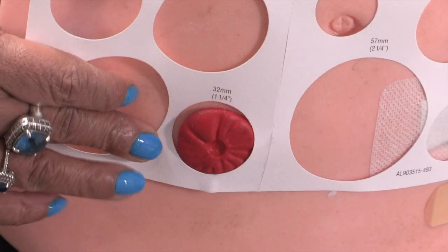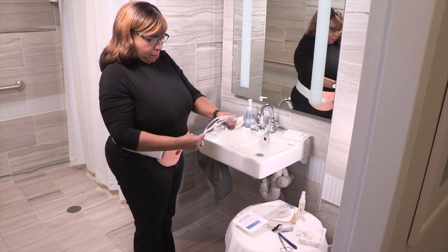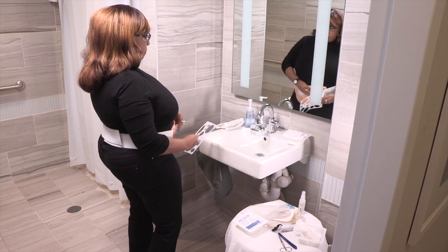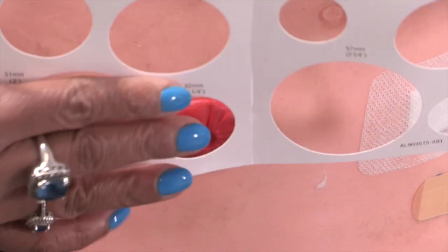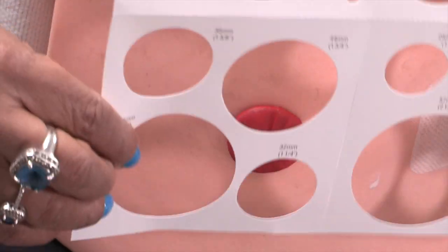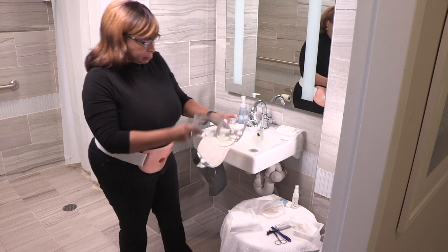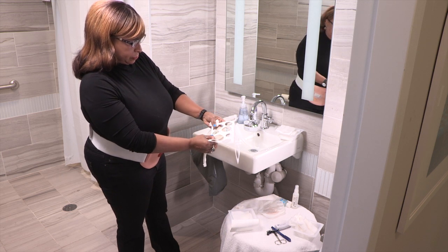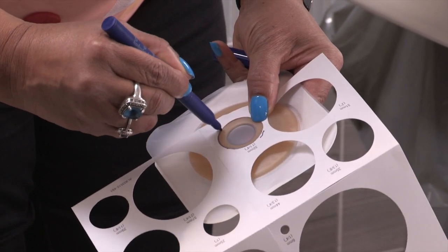Your stoma will slowly get smaller over the first 6 to 8 weeks after your surgery. During this time, use a measuring guide to measure your stoma and fit the wafer every time you change your pouching system. Once your stoma reaches its permanent size, you can start using a pre-cut wafer. Usually, a convex or curved wafer is best. Compare the holes in the measuring guide to the size of your stoma and choose the hole that fits exactly around your stoma with no gaps. Place the measuring guide over the back of the wafer and use it to mold or cut the wafer to the exact size you need. Some wafers have lines to help you, and you can also trace the correct size onto the back of the wafer.